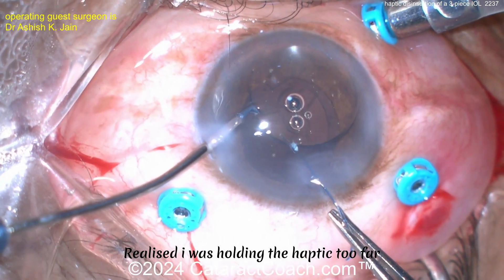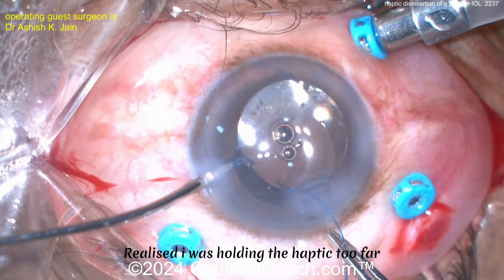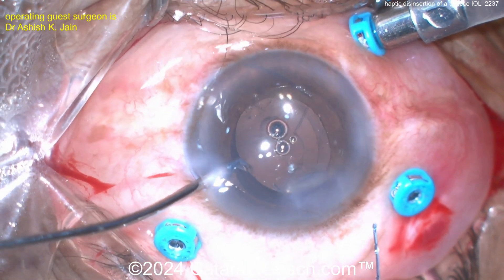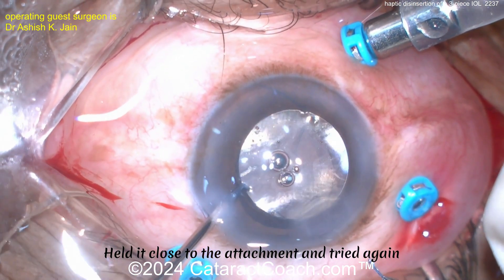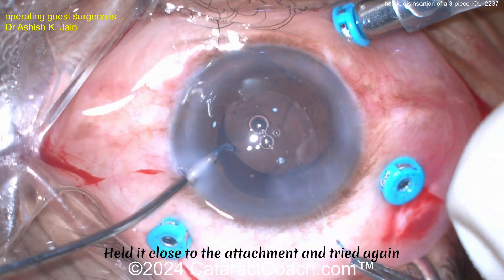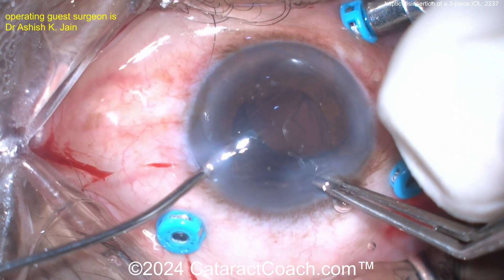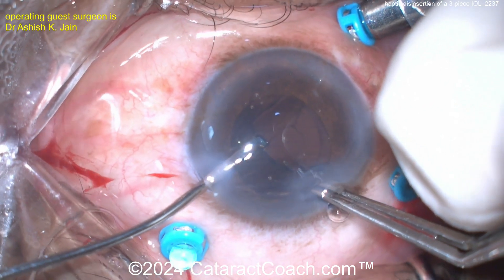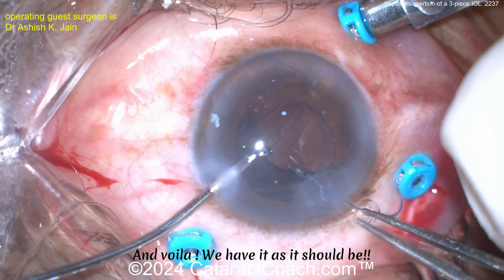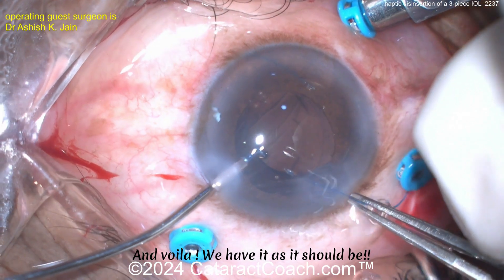You may be surprised to find out that typically glue is not used to place these haptics. In the factory where they make these three-piece lenses, a technician — an actual human being — uses his or her hands under a microscope to manually put the haptics into the optic. They're wedged in there and it's a friction fit, so you can put it back in; you just need to hold it closer to the end so it doesn't flop around on you.